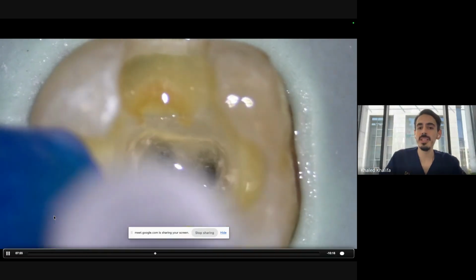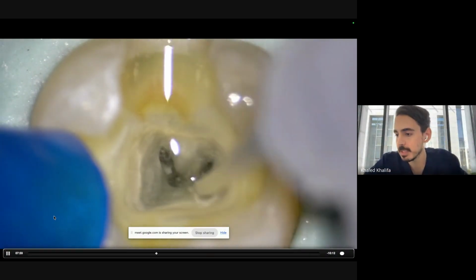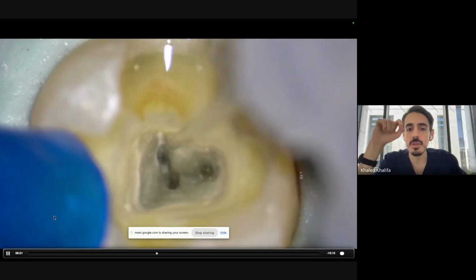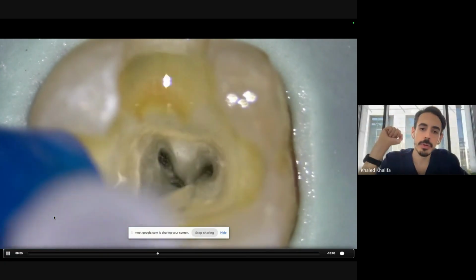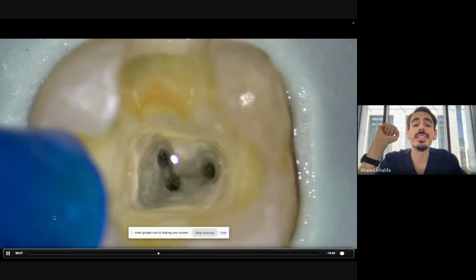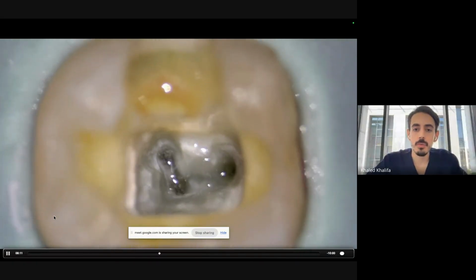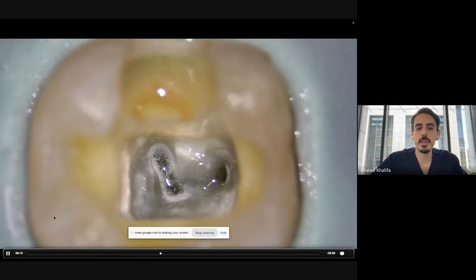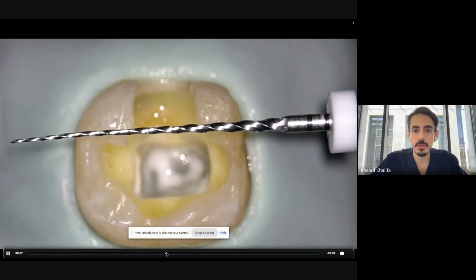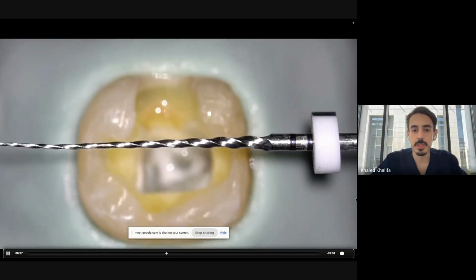If you're not gonna proceed manually in this case, this is when you take the full working length of the case. You take the full working length of the canal after orifice opener, not before, because the working length changes significantly. Okay? After this, you can see the sodium hypochlorite started to eat the pulp tissue inside the canal. Okay? After doing this, we're gonna proceed with the glide path rotary file, 15 taper 3.